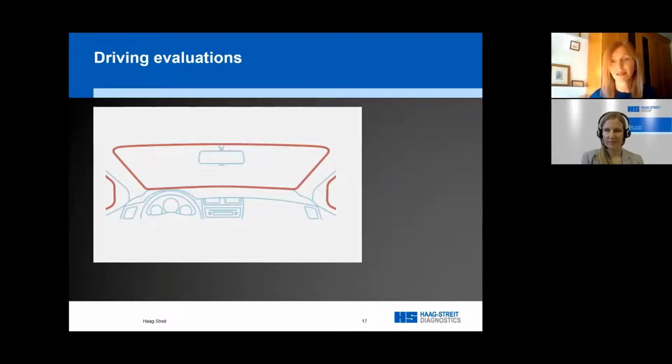An example would be a borderline result, where there might be some losses within the central 40-degree area or on the peripheral boundaries. We would use kinetic testing to outline those areas in more detail to show whether the defect is extensive or not for that particular area that's questionable.